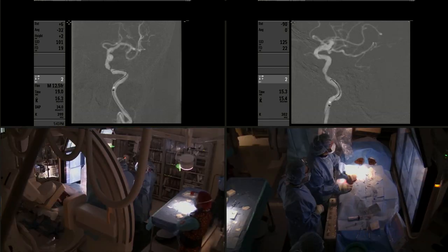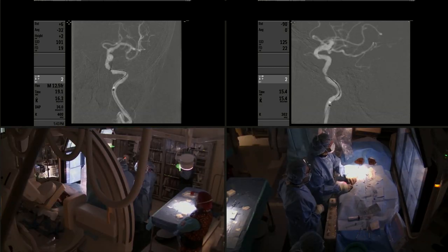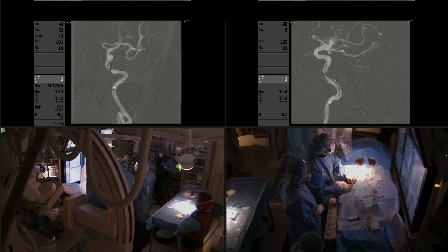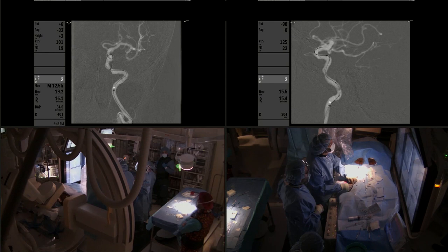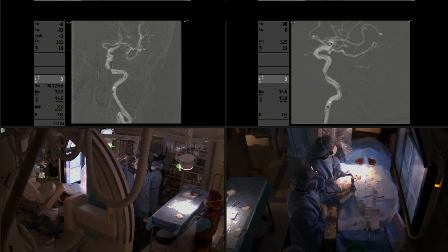We are very careful to make sure that we do not bend the tip of the delivery catheter. Now we're advancing the system. The microwire is already loaded with the balloon catheter.